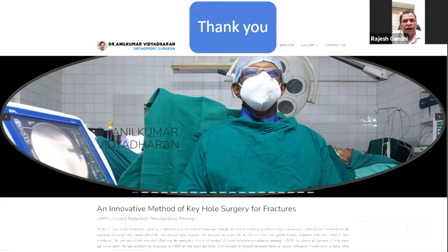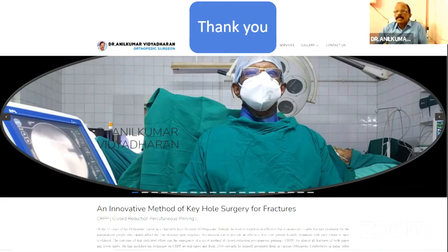How many wires do you generally put? The common numbers like 3, 4, 5, or as much as required? Generally I am using 4 wires, that is 2 from the lateral side and 2 from the medial side. Depending upon the local conditions, I may reduce it from the medial side. If I cannot put 2 wires, I will restrict it to 1. From the lateral side, it is very easy, and you can use 2 wires. In one of my cases, the lower third of the humerus was also fractured, with a separate butterfly piece, and I fixed it with additional K-wires from that side also.